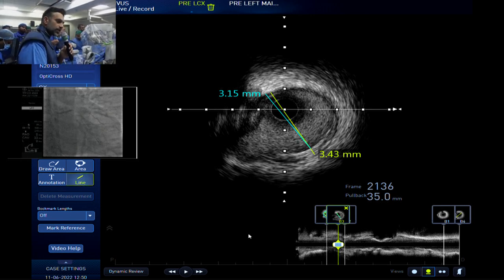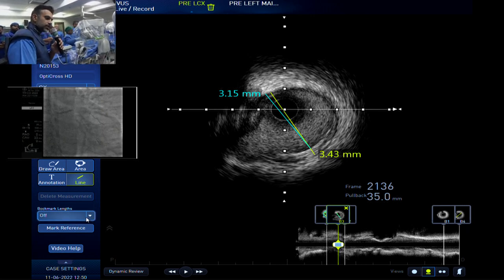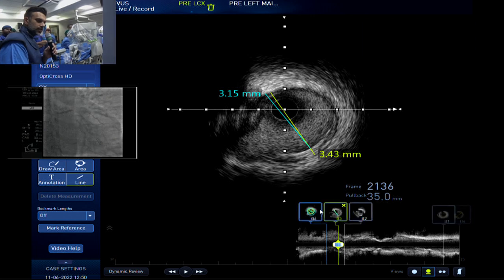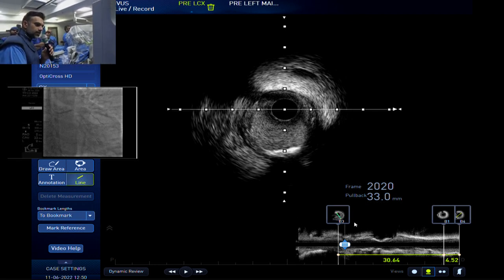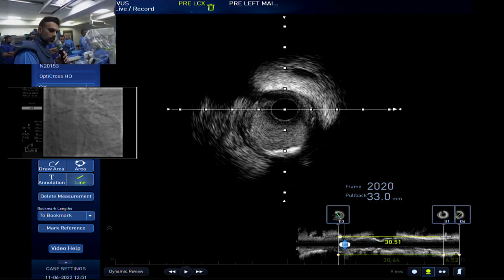And now let's just do a line length measurement, right? I usually do this manually, but there's a variety of ways. You've got bookmarks here, right? So let's get rid of the other bookmarks just to make things easier, right? So we can get rid of this, okay? And now you just go length measurements to bookmark, right? Alternatively, you can take the line and you can physically measure from here to here or to here.